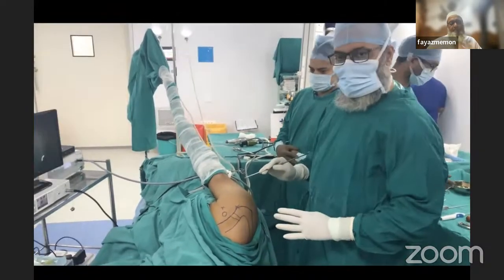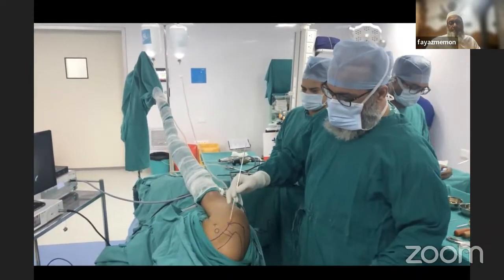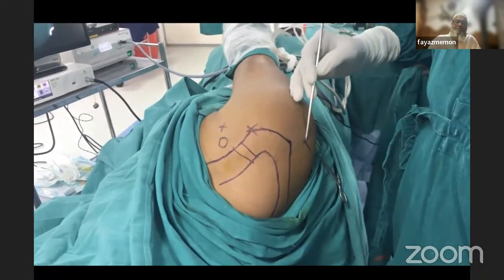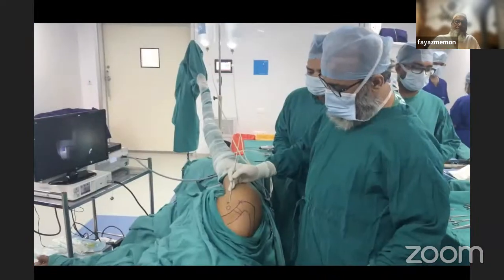This is a Bankart repair surgery, which is a glenohumeral procedure. That's why I have just marked these 3 portals which are required. If required, we can have other portals. This is the coracoid process. This is my posterior portal, which we start from. This is the anterior superolateral portal. This is the anterior portal.